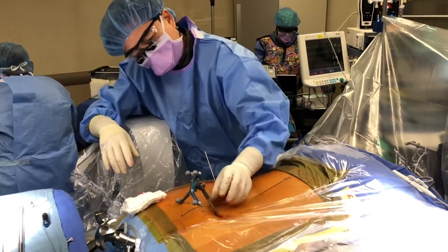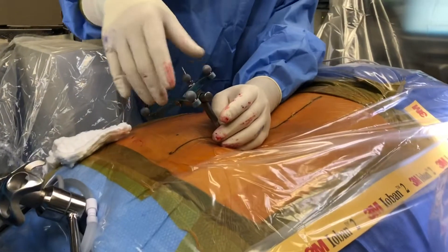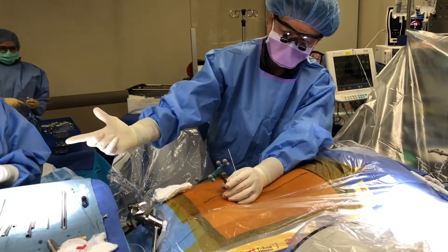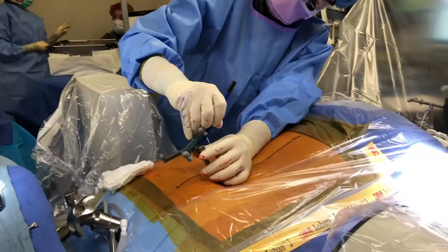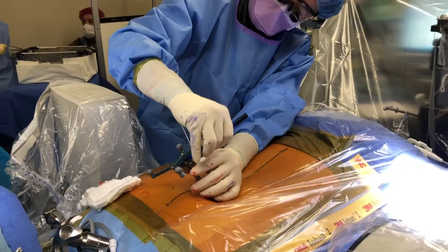You make sure everything's all lined up, and that the bumpable component of it is in the right spot. When I find the right configuration with the marking pen, I look to make sure it's all clicked together and stable, and then I mark it so that if at any time during the case it's changed, I'll be able to tell.